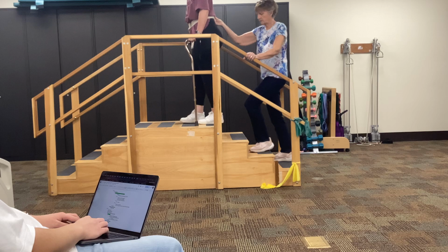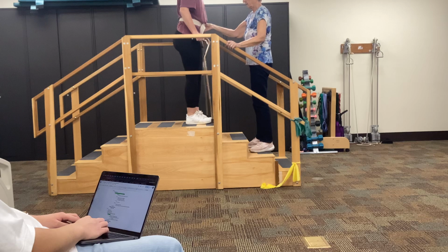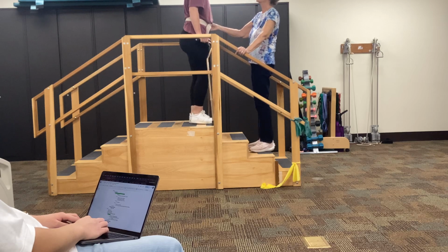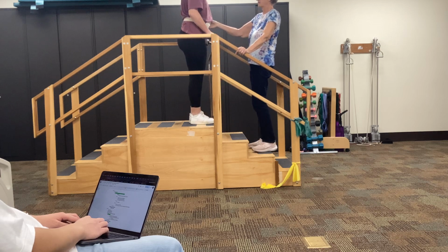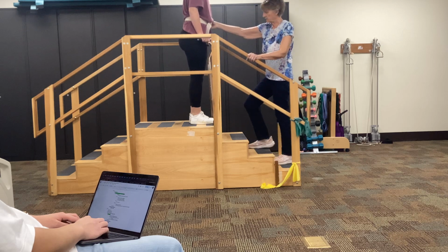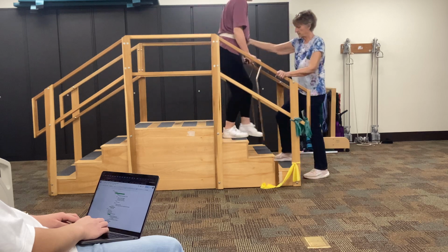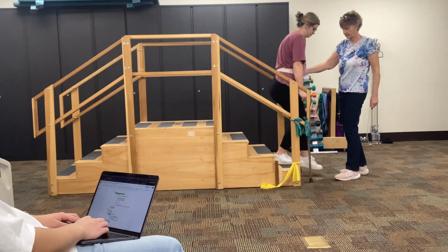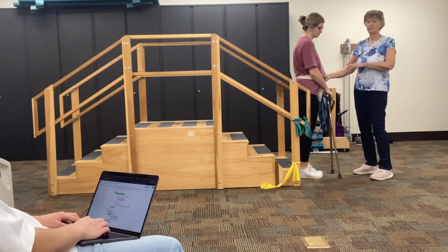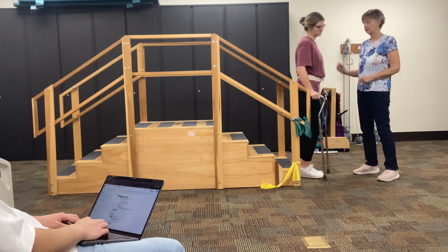Okay. So go ahead and turn yourself around. All right. How does coming down look? Okay, pick up. Which is your bad side? The left. Okay, you said your right was your stronger side, right? Okay. So left and cane's down. And the right. Left and cane's. On the right. Okay, so that would be the very base, the safest way to do it. So go ahead and turn around.